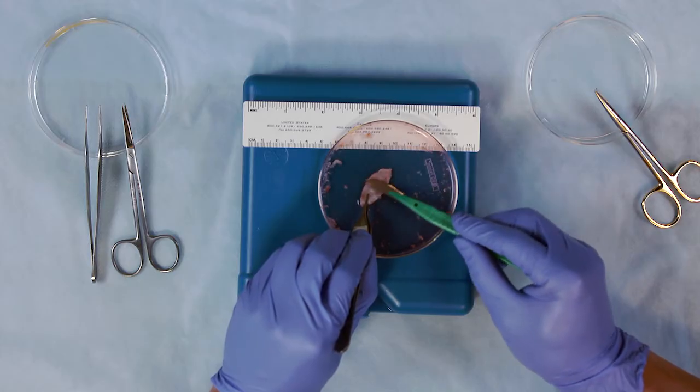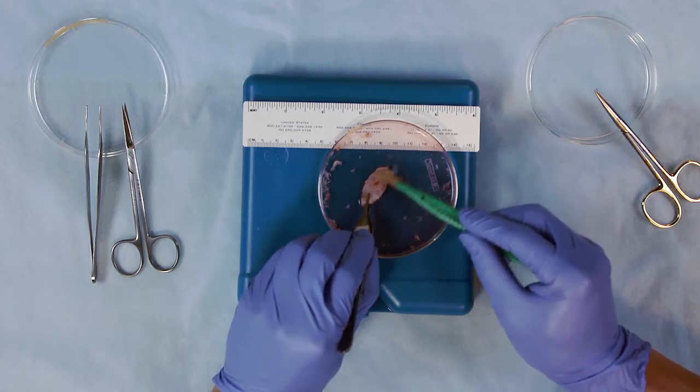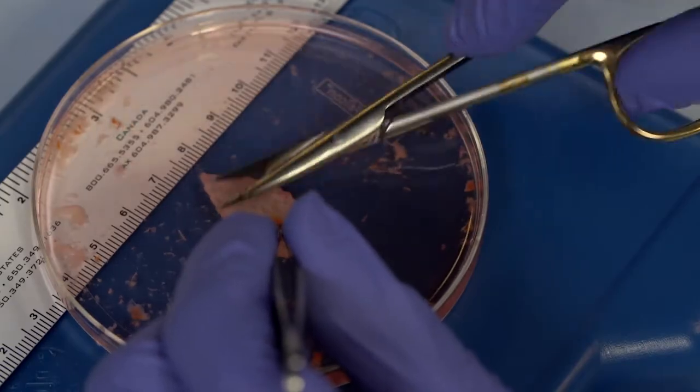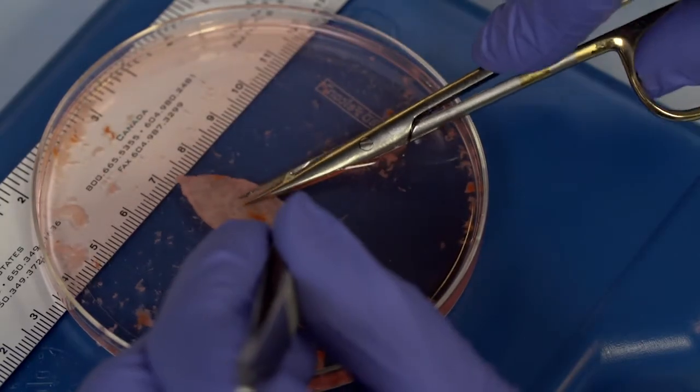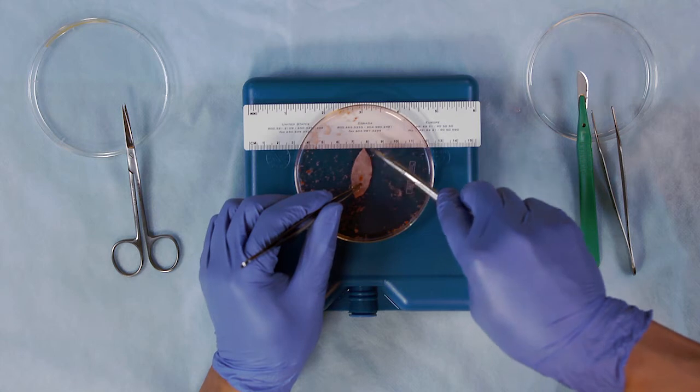From personal experience, a curved scissor usually is enough to trim ovaries from patients who are teenagers or younger down to one millimeter, while a number 10 scalpel is used mostly to thin the cortex for patients who are older.